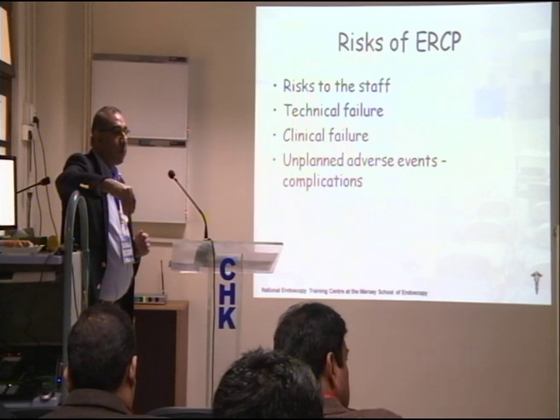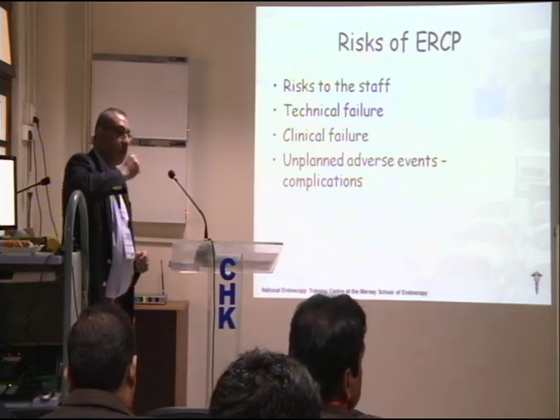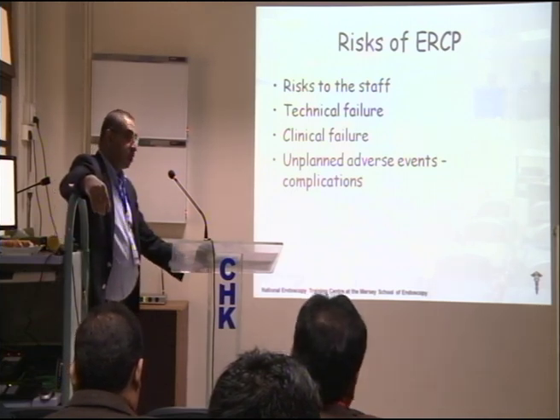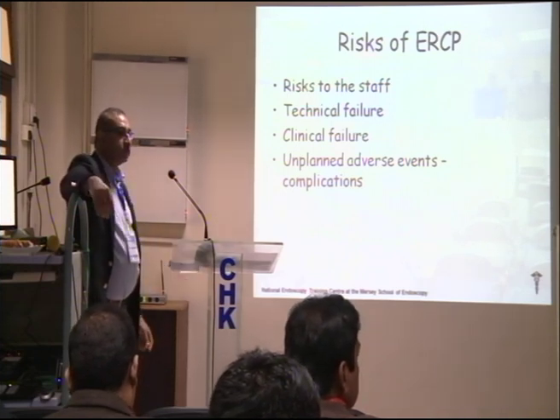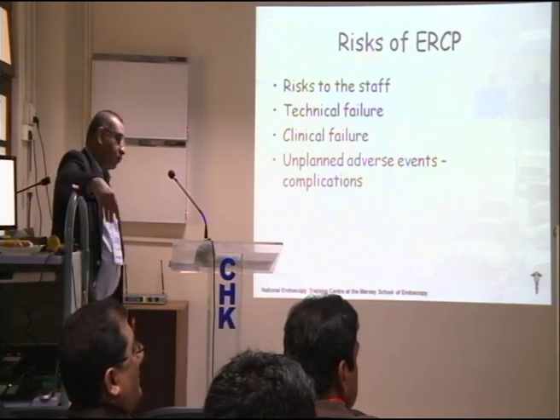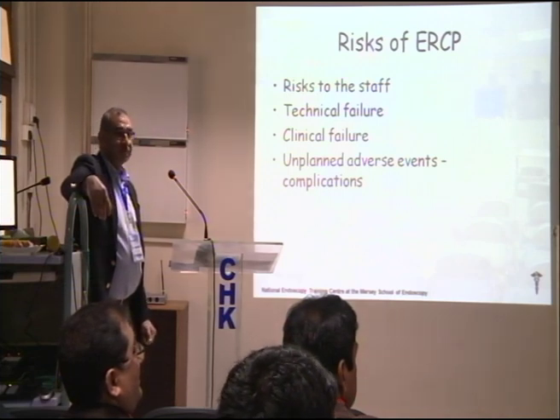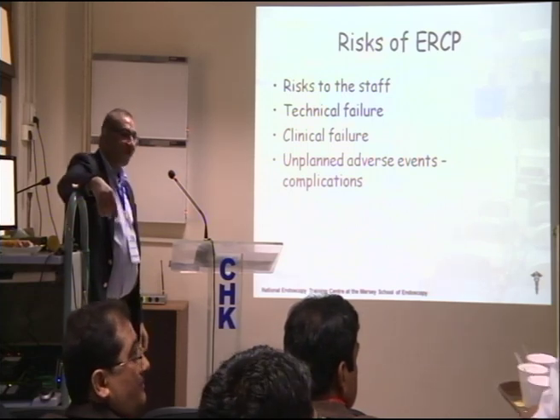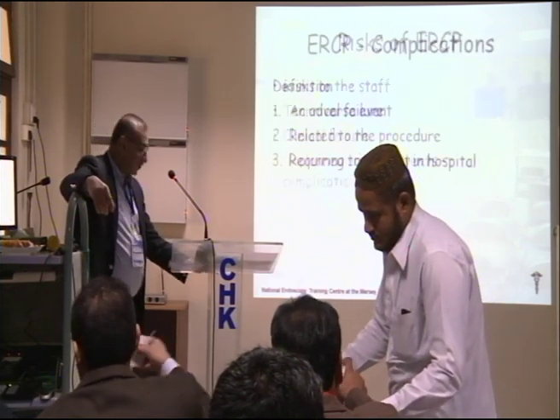So the range of pancreatitis is pretty variable depending on centers and the volume you do. If I'm not wrong, around 2.5 to 3% would be on the lower side, and it has been reported in the literature up to 18%. But obviously, if one center is achieving 3% and the other center is having 5 times that, there is a problem. A serious problem. So I think 3 to 5% is acceptable. We'll give you the figures, don't worry.